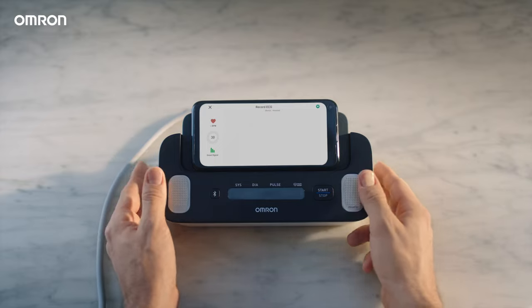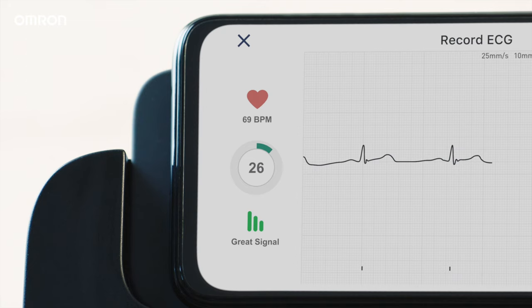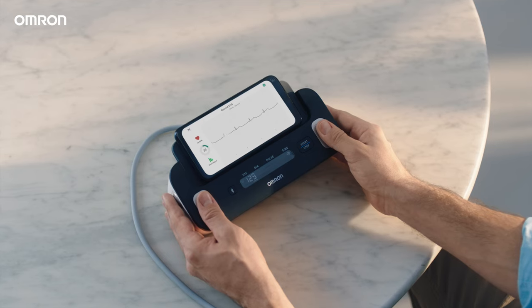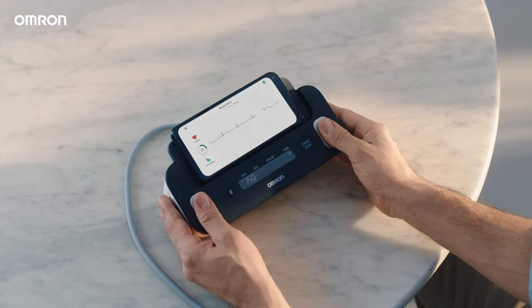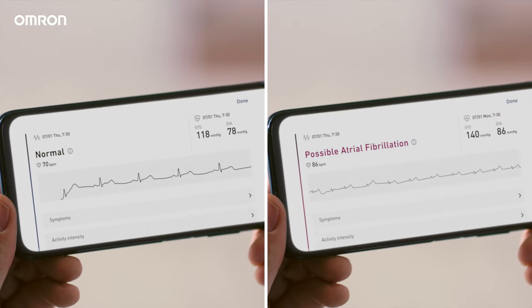Press the start button and put your fingers on the electrodes. Remain still until the arm cuff deflates and the 30-second countdown for ECG recording is complete. And know if your blood pressure and heart rhythm is normal or if possible atrial fibrillation is detected.